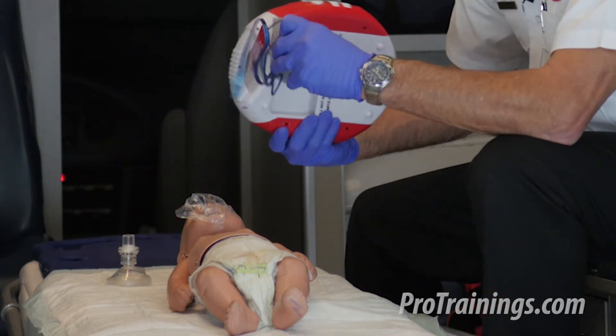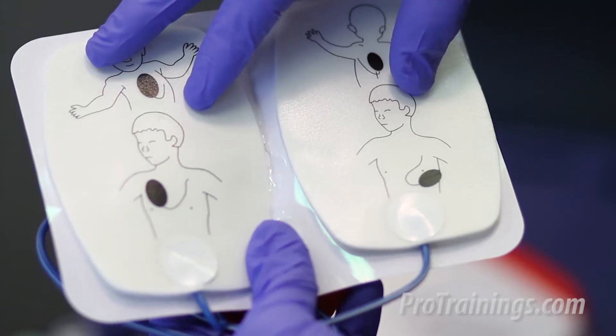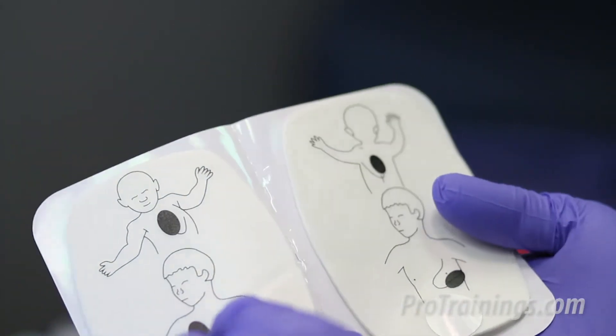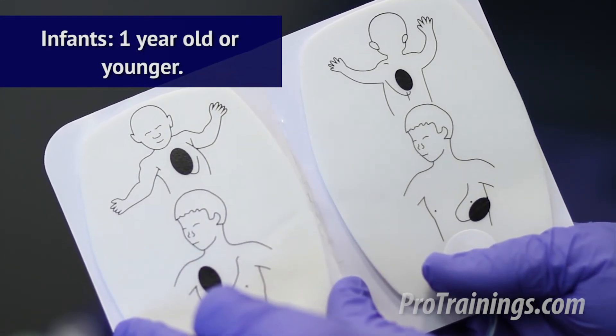The AED is prompting me to attach the electrodes, so I reach in and grab the infant size electrodes. If I didn't have infant size electrodes, I can use adult size electrodes. But if infant pads are available and it's an infant size patient — which is one year or younger — I'm going to use the infant pads.